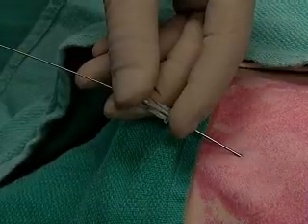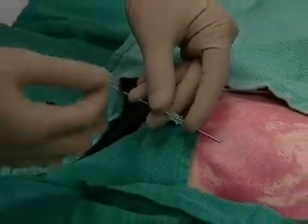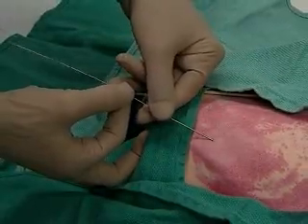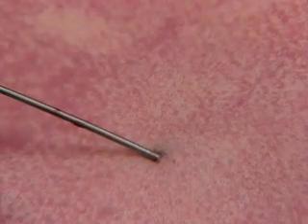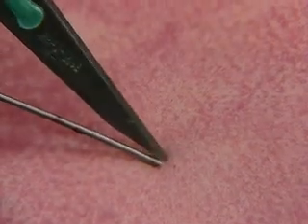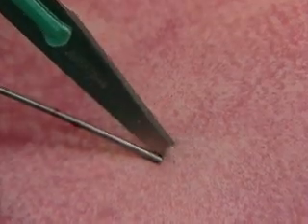You see the wire exposed. Hold the wire as you carefully remove the needle. At this point we'll take the 11 blade with the sharp edge up to make a small incision where the wire enters the skin. This will facilitate the passage of the catheter.